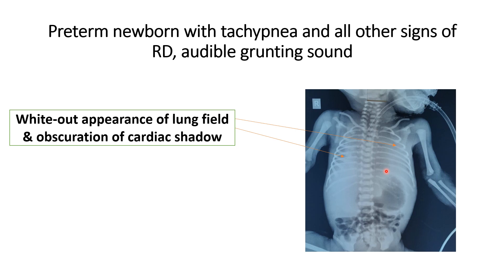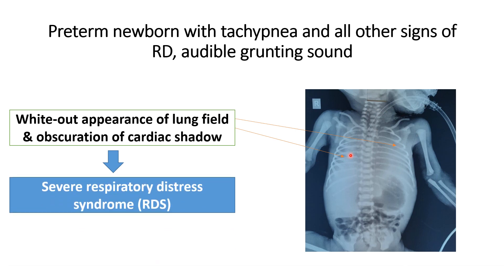Indirectly, whenever there is any intrathoracic lesion — or any lesion in the lung field or mediastinum which touches the border of the heart, aorta, or even the diaphragm — that border is obliterated; you are not able to differentiate between the border and the lesion, and the terminology we use for this is the silhouette sign. The diagnosis for this x-ray is white-out appearance of the lung field and obscuration of the cardiac border, characteristically seen in a case of severe respiratory distress syndrome in a preterm newborn.